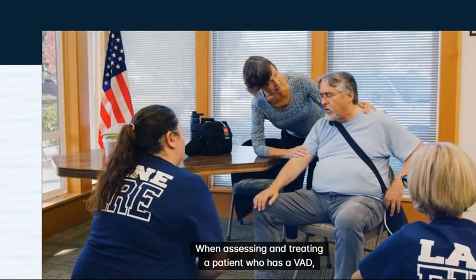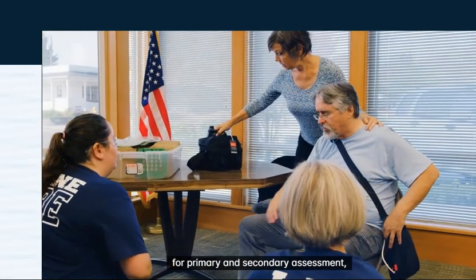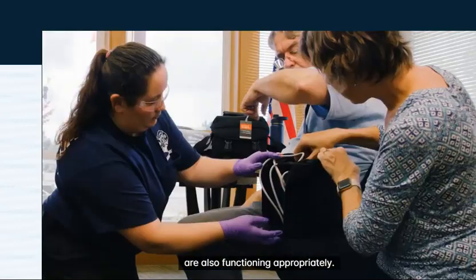When assessing and treating a patient who has a VAD, follow your standard protocols for primary and secondary assessment and for managing immediate life threats. When you're assessing a patient with a VAD, you want to make sure that all the components of the VAD itself that are outside the body are also functioning appropriately.